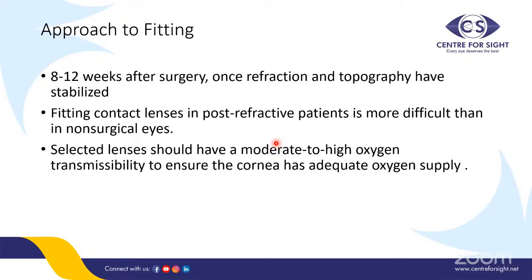And fitting in a post-refractive patient is more difficult than in non-surgical, unaltered eyes. The reason is that post-refractive surgery patients might already be slightly disappointed with their outcome. They may not be receptive to other treatment options, and some patients may feel that they underwent refractive surgery to remove their refractive power, and ultimately they have to wear contact lenses. So thorough chair time and evaluation is very important for such patients, and it is very important to motivate them so that they may use contact lenses for an extended period of time.